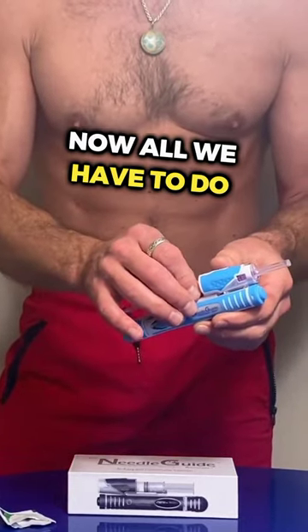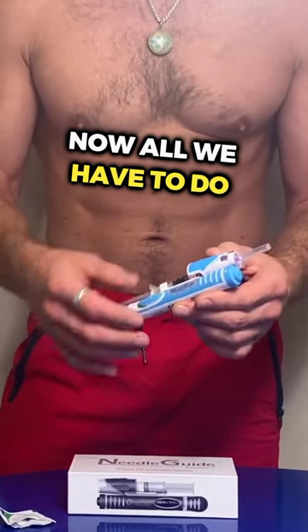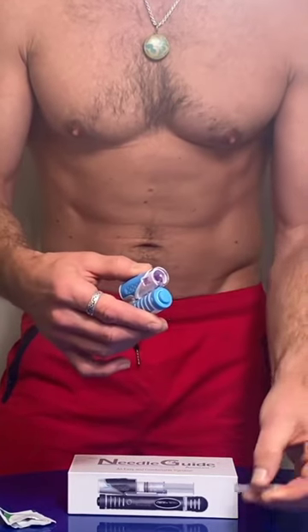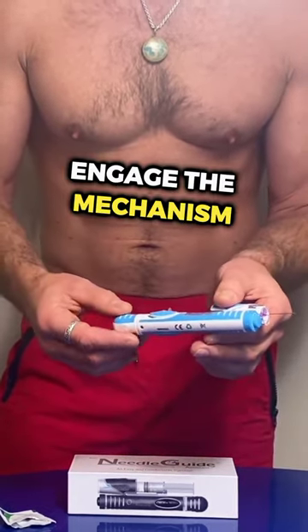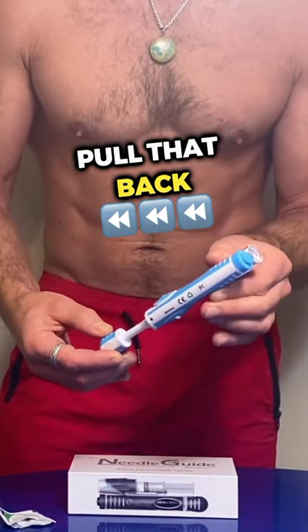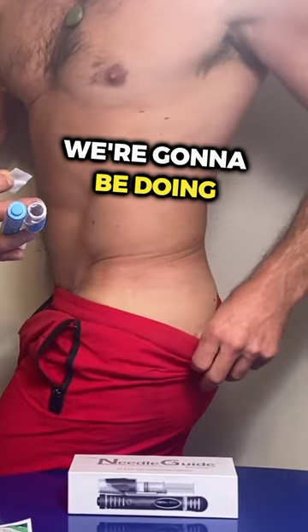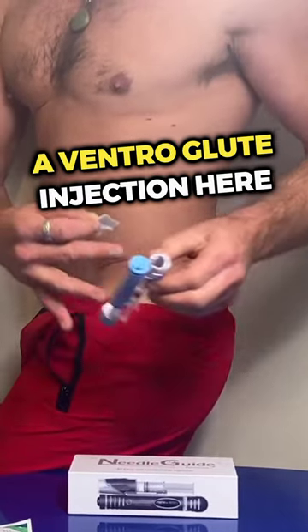Our syringe is loaded in the needle guide. Now all we have to do is remove our cap, engage the mechanism, pull that back, take our alcohol swab. We're going to be doing a ventral glute injection here.